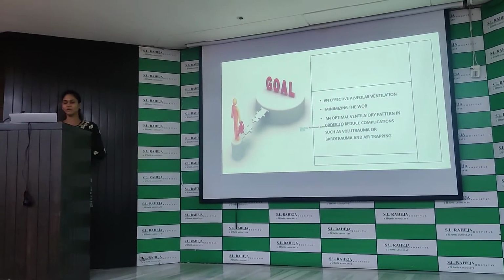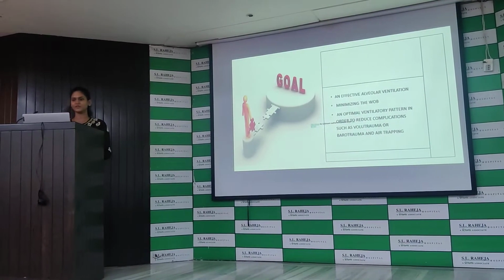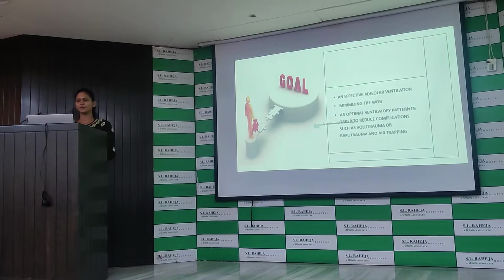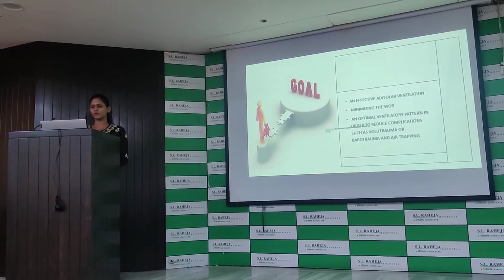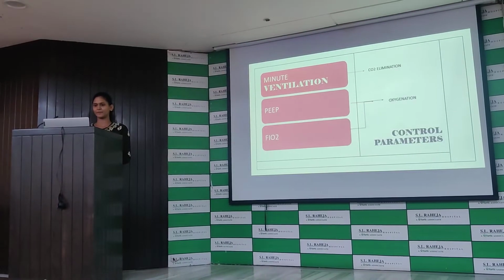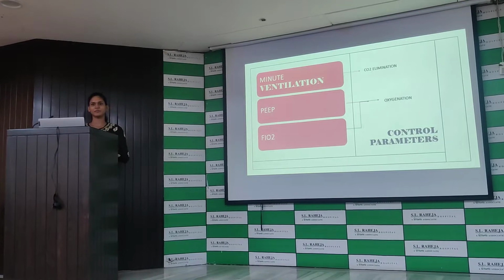So what is the goal of this mode? It is to have an effective alveolar ventilation, minimize the work of breathing, and have an optimal ventilatory pattern in order to reduce complications like volume trauma, barotrauma, air trapping. So what are the control parameters we set? Minute ventilation, PEEP and FiO2.